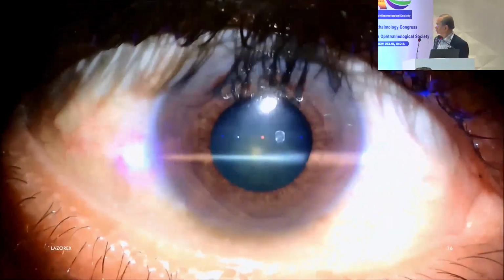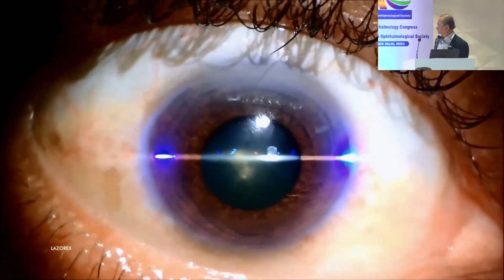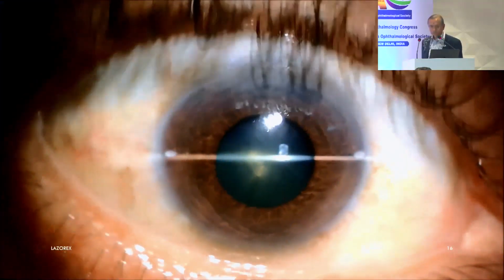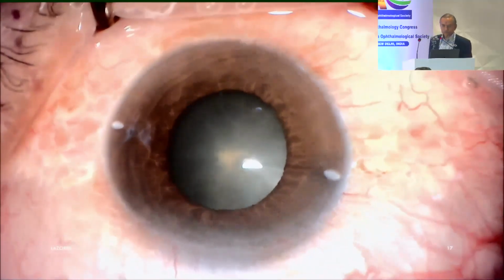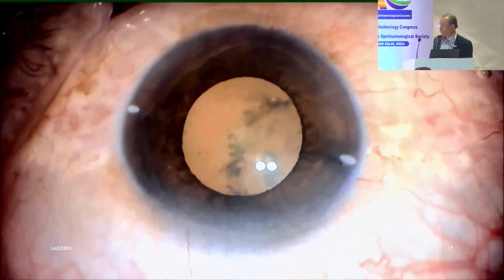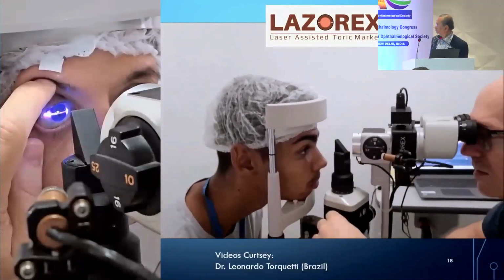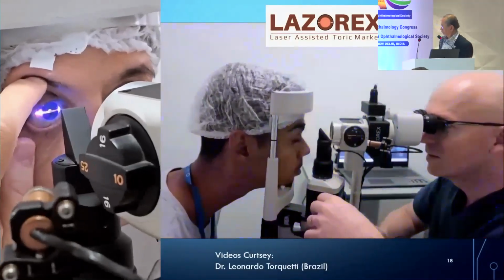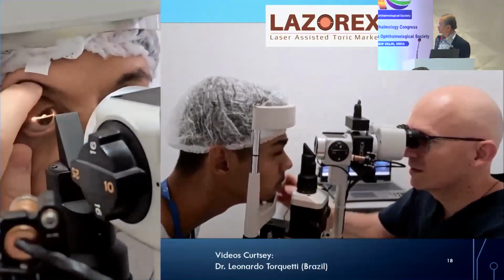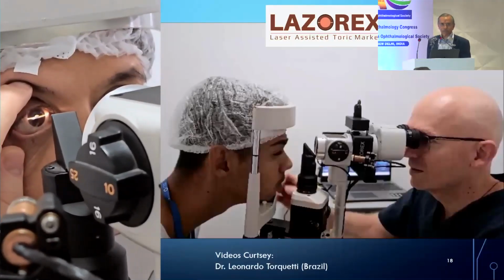Another case. Same case on the table. Notice the clockwise cyclorotation in the supine position. It is also a good method to do laser markings before dilating the pupil, keeping the slit horizontal and passing the slit through the center of the small photopic pupil. In this way, it is easier to align at the 3 and 9 o'clock positions.